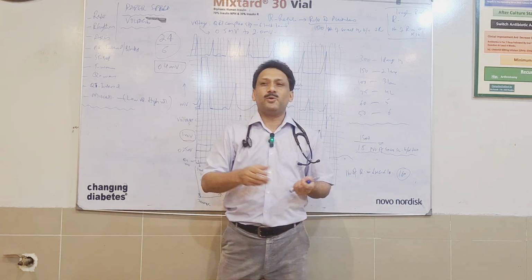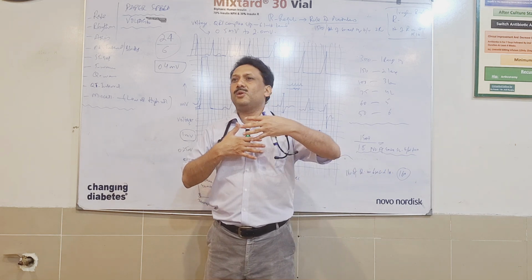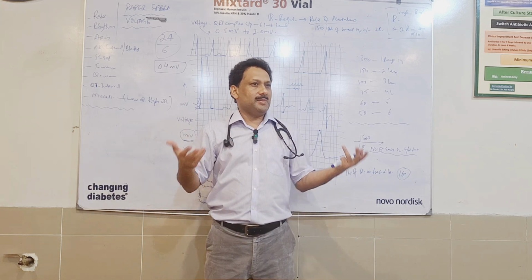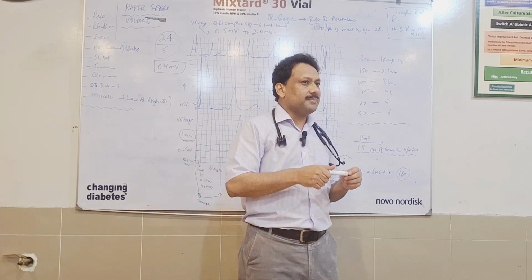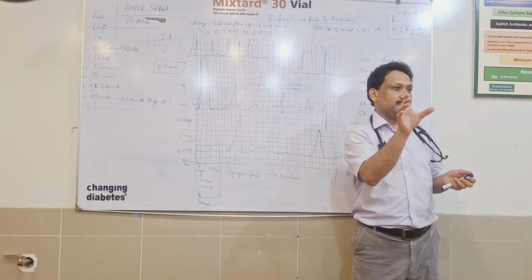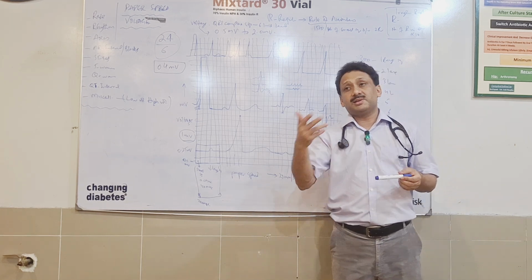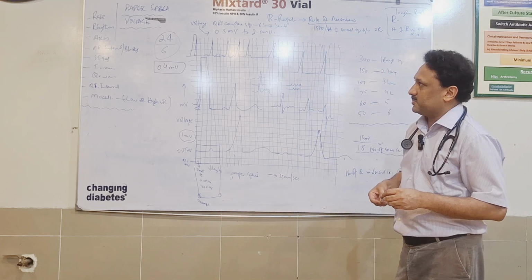This is fluid. A person is very obese. Now there is a lot of fat between the electrodes you are placing and the heart. The heart is emitting current, but the problem is there is a lot of fat. So the patient would have low voltage ECG. And high voltage ECG will be in those situations where the walls have become thickened. The stronger the wall of the heart, the stronger the current it will dissipate, and as a result the voltage can be quite high. This is what I will be discussing later as well.